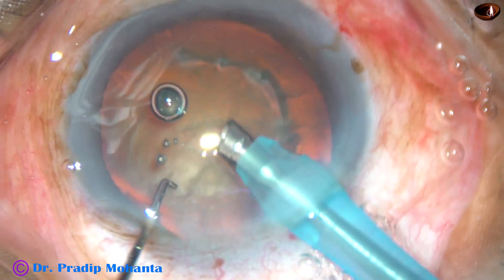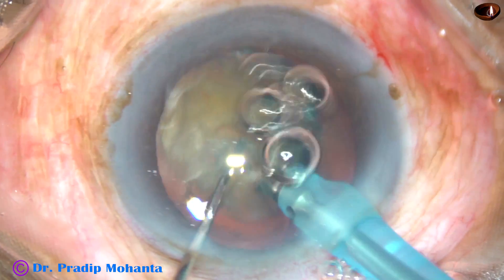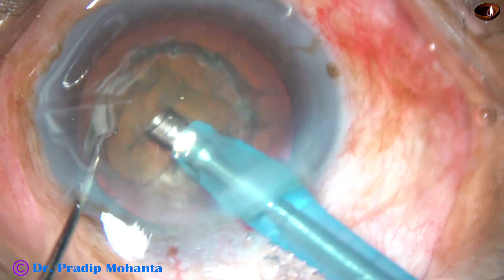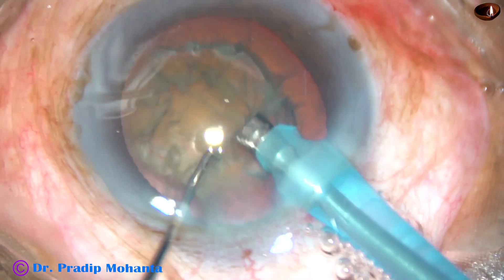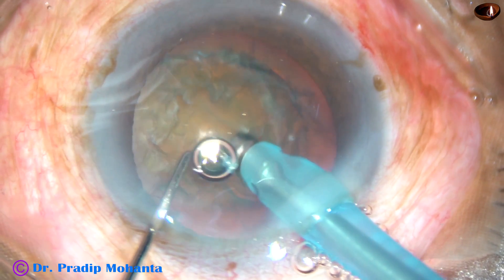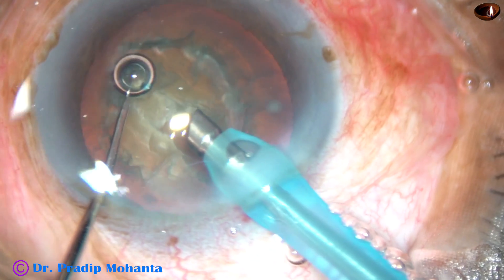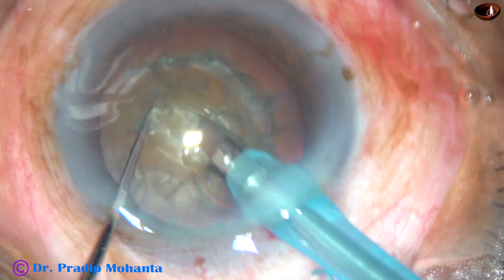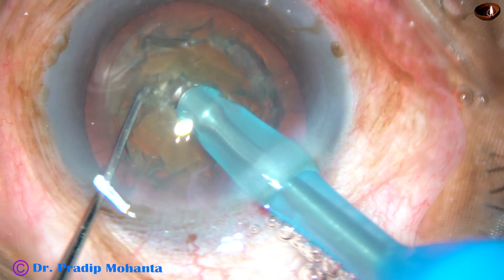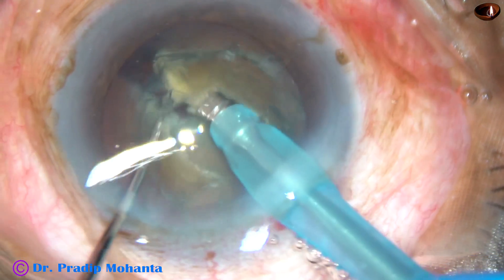In such consistency of nucleus — when the nucleus is of medium density — I usually do direct chop. Some superficial lens matter has been removed. And now this air bubble is disturbing me. It is removed. Now I chop the nucleus firmly, and this is the first chop.